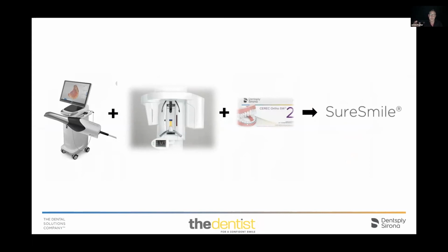And yes, I have to make refinements. You know, I'd be lying if I said I didn't. Some cases need more than others. But now that I'm using the actual software to the best of its ability, I'm controlling the movements I'm doing and I'm making the movements easier, which means that moving forwards, I'm going to be having fewer refinements because I'm making movements easier and in a more controlled way. And those root positions that I can see, I'm making those movements easier for me using tipping rather than bodily movement. You know, and if I need to compromise, I'll compromise, but still giving the patients the results they want.